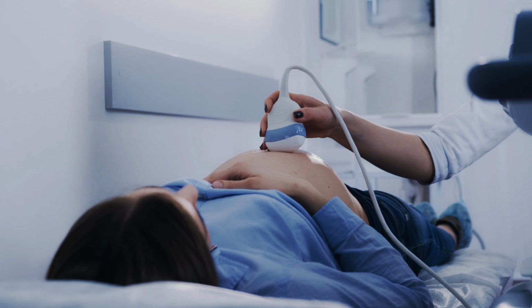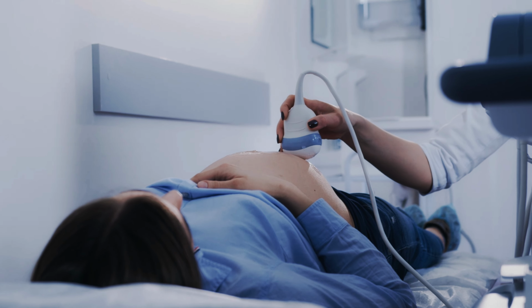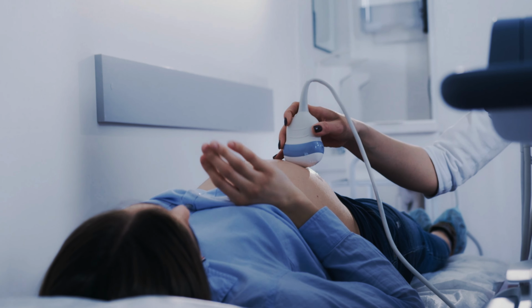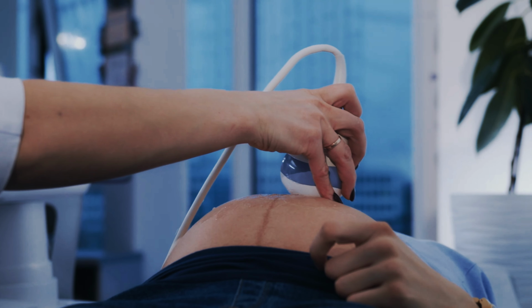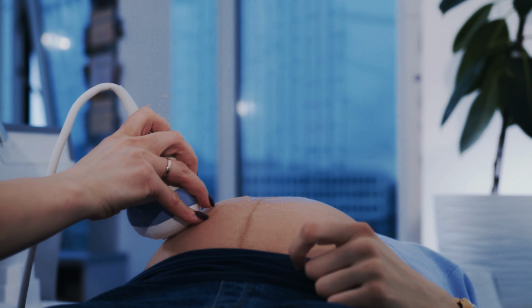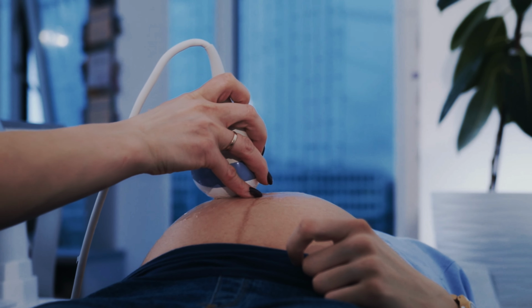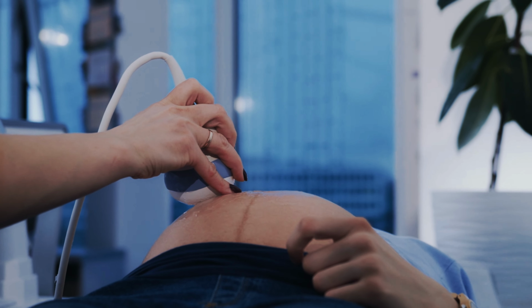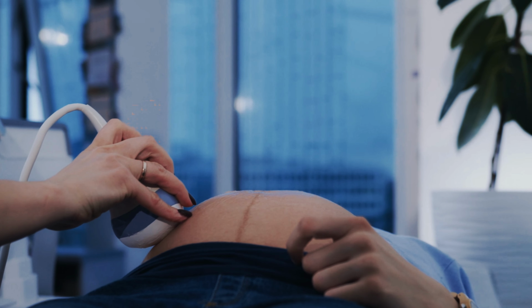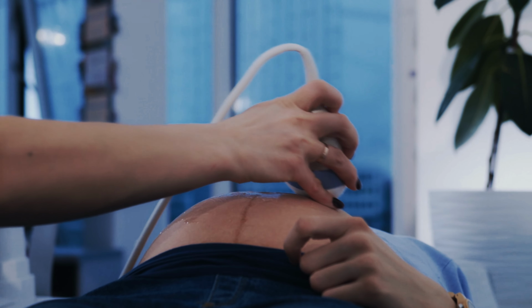Types of ultrasound. 2D ultrasound. This is the most common form of ultrasound, producing flat, two-dimensional images. It is often used in routine examinations, such as monitoring fetal development or diagnosing abdominal conditions. 3D ultrasound. This technology creates three-dimensional images by compiling multiple 2D images taken from different angles. It is particularly useful in detailed imaging of fetal anatomy or tumors.